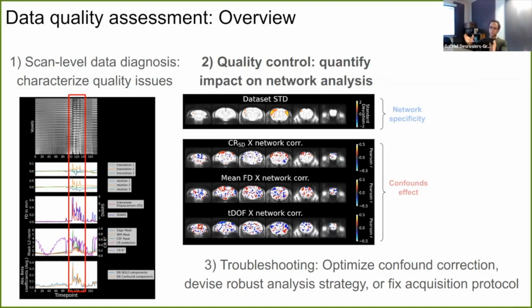There's a generic report that's generated, which you could generate in each of your groups separately or across both of your groups together. But there are also a lot of outputs generated with this report, such as measures of mean framewise displacement, which you could load yourself. There's a bunch of CSVs with metrics you can load during your analysis and maybe control for in a linear model as much as possible.